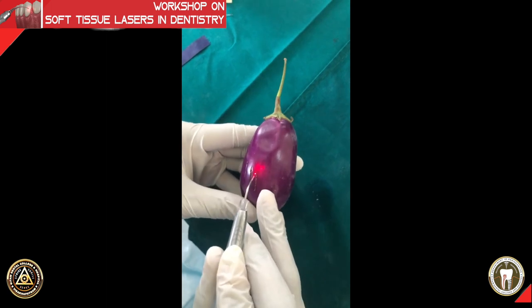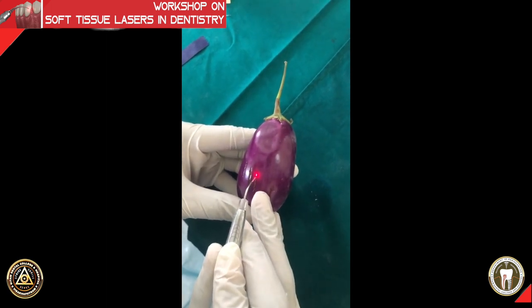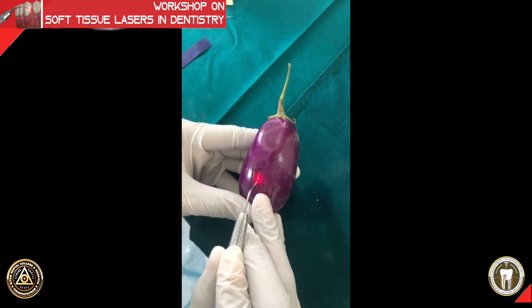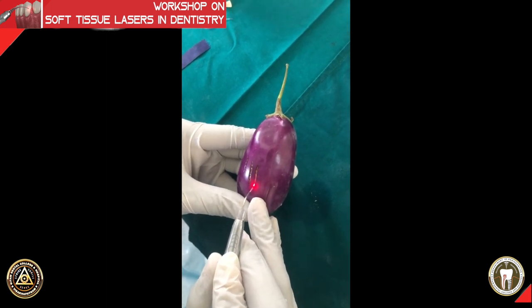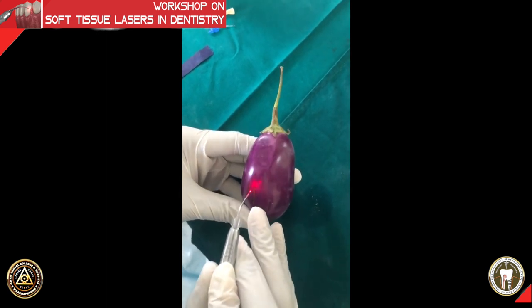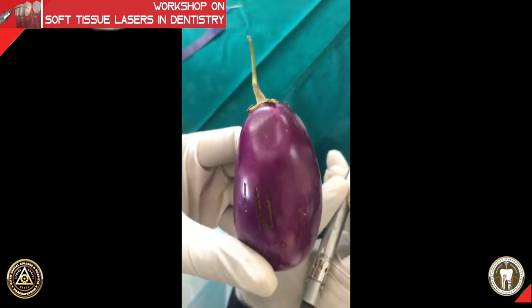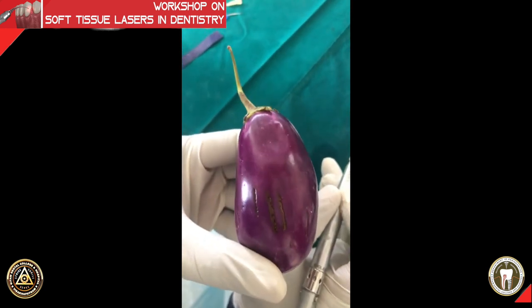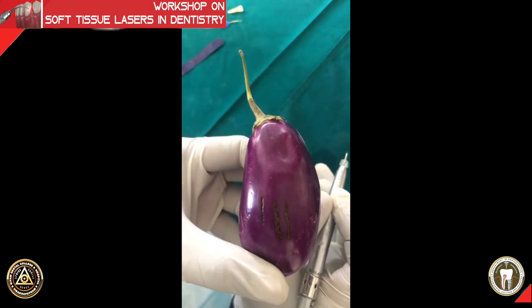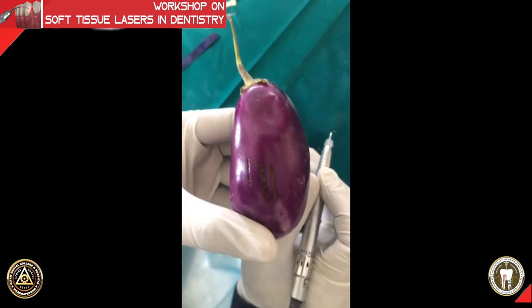We are doing the layer cutting again — cutting in the same place again. Now you can see the difference between the continuous wave and the pulse mode. The pulse mode has a lesser zone of cut, but the amount of thermal damage is also reduced.